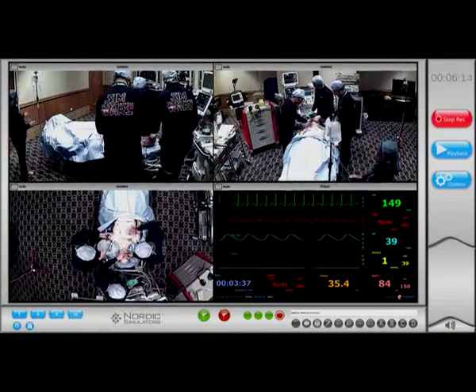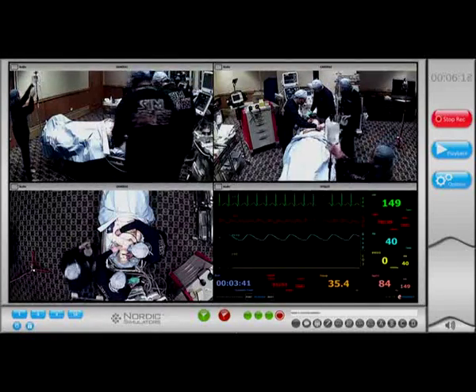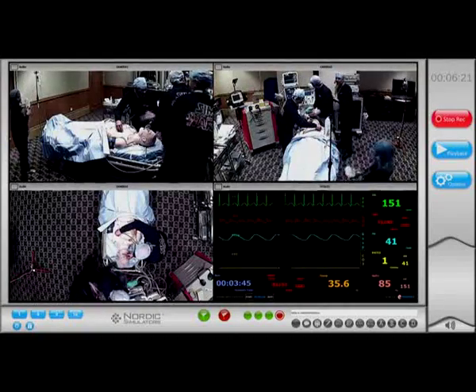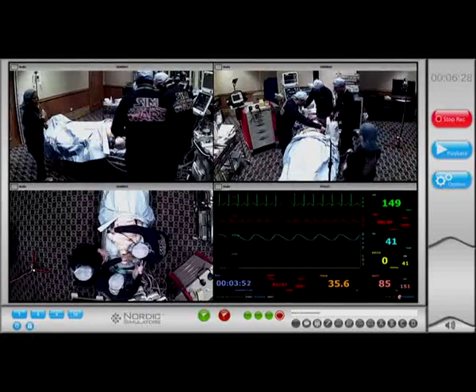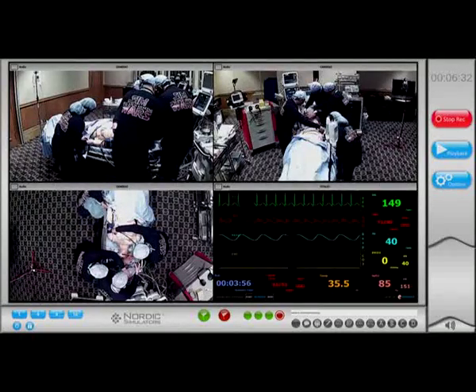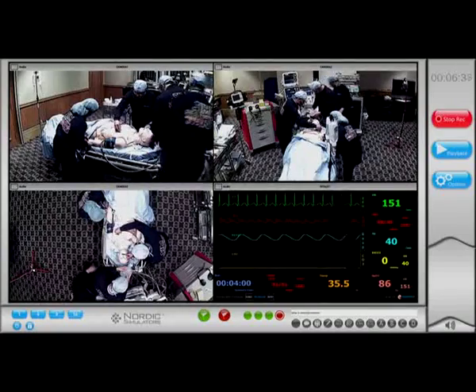Do we still have a pulse? Ventilate. We have a pulse still. Okay, ventilating. Why don't you use the ambu bag with oxygen? Let's use the ambu bag with oxygen. Yes, connect the oxygen. It's okay, Dr. Yasser. Capnography connected? Yeah.